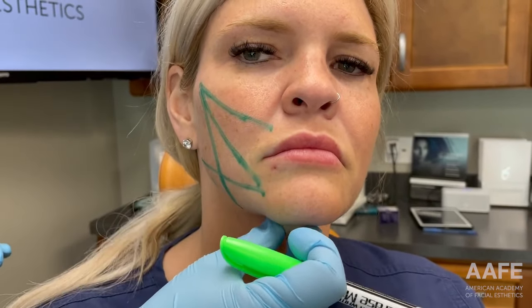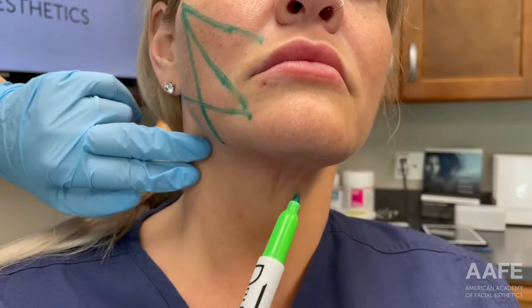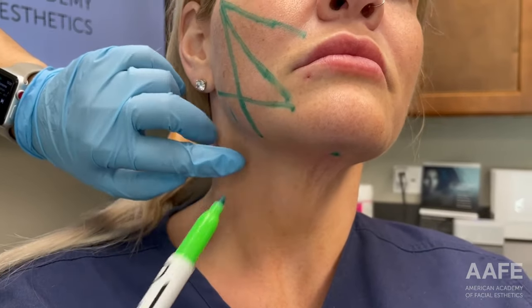We're going to do a little bit on her neck too, which is what we teach in our PDO level two courses. She has a little bit of laxity in the neck that we're going to try and improve as well.